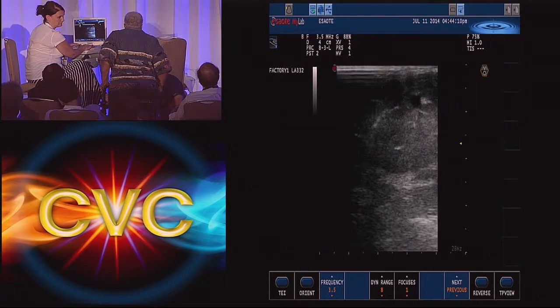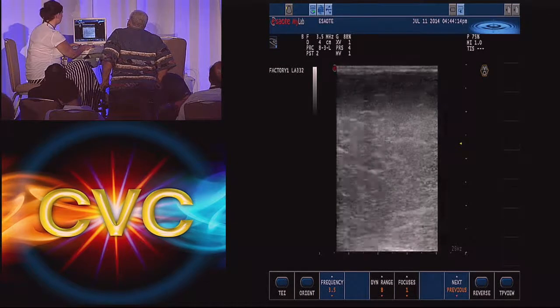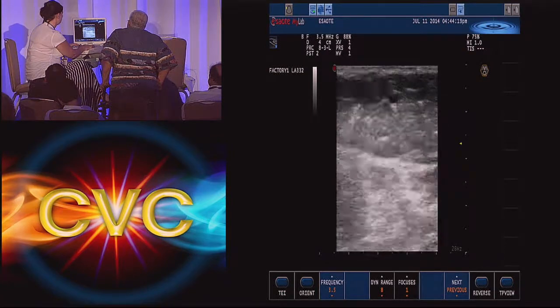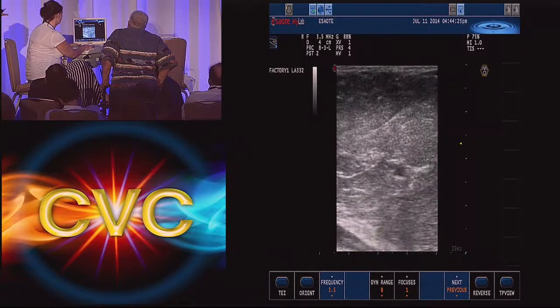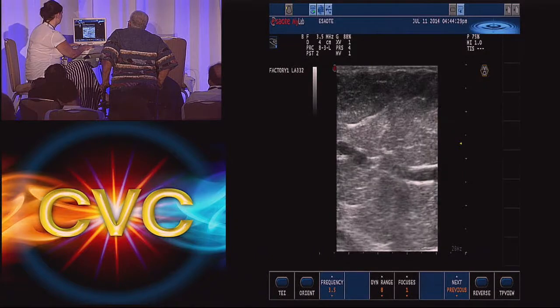The other thing we do is we've got a little stand created. I think some are available commercially. They're like three steps, and they stand on top of that. Because you can have people go vasovagal just standing for a while. They're already anxious. They don't know what's going on. And some of these, the full mapping, all of it can take 20, 30 minutes if you do a proper study.